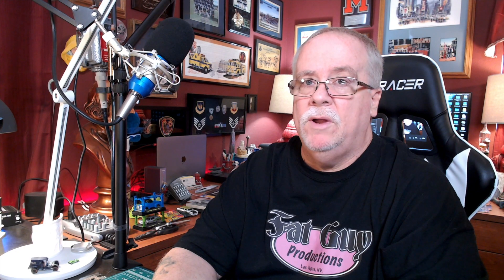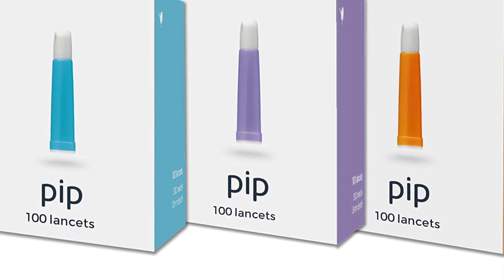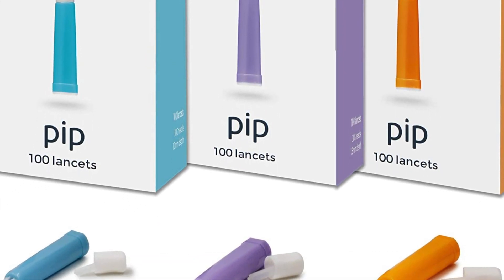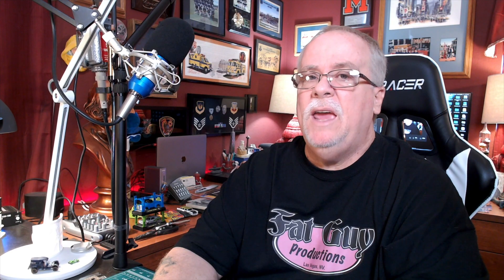You'll get samples of all three of their lancets. The first is a 30-gauge, 1mm depth. The second is a 30-gauge, 1.6mm depth. And then, finally, you have the 28-gauge that goes to a 1.8mm depth.